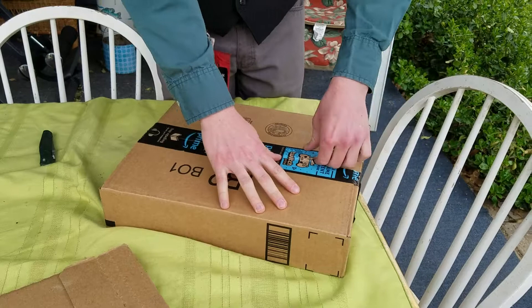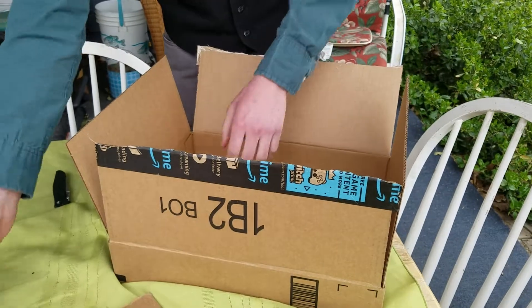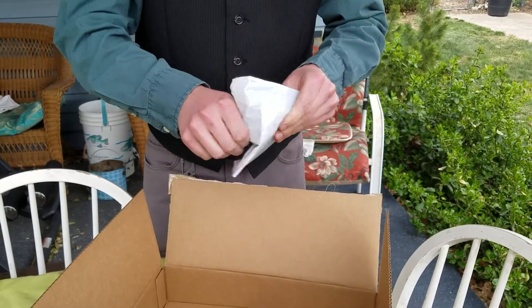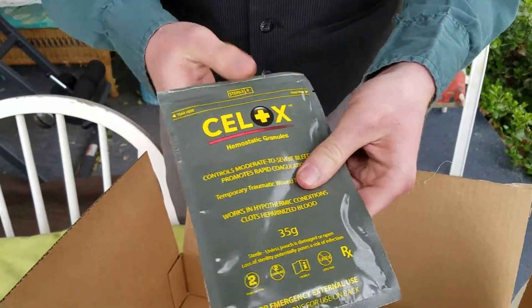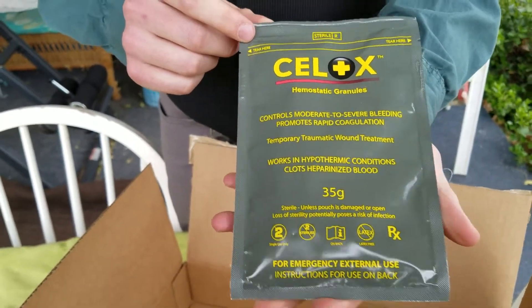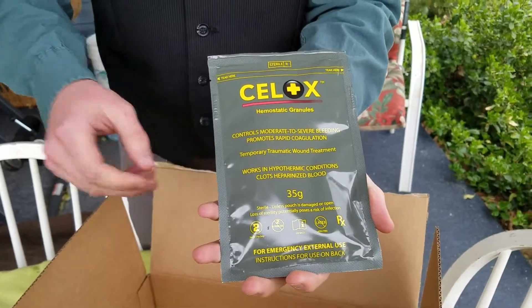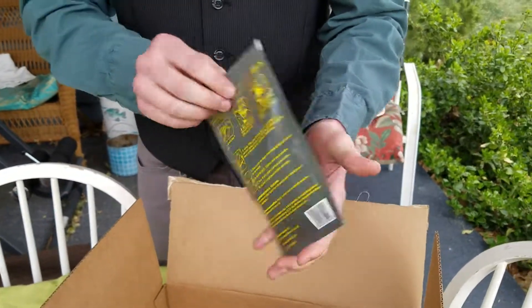First thing here is the Celox hemostatic granules. This is what I was referring to in my last video — something I was gonna get in the mail soon, and here it is. Basically this is a hemostatic agent that's a powder; you pour it into the wound and apply pressure to stop the bleeding.